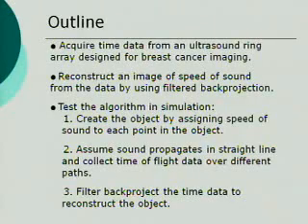This summer I worked on an integrated microwave-ultrasound imaging system. My work involves heavy MATLAB programming, so the goal is to build a programming tool to analyze acoustic data and reconstruct ultrasound images. My mentor is Professor Magnum, and I'm working with Mark Haynes. Here is a brief idea.